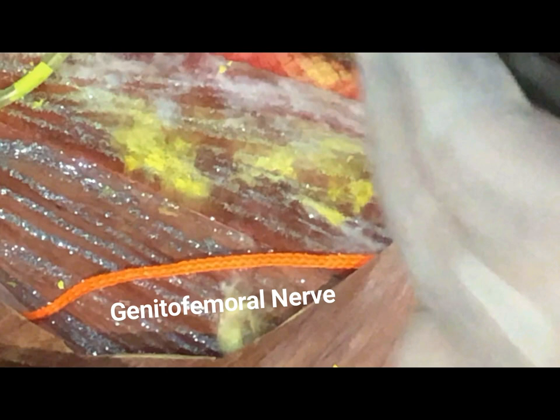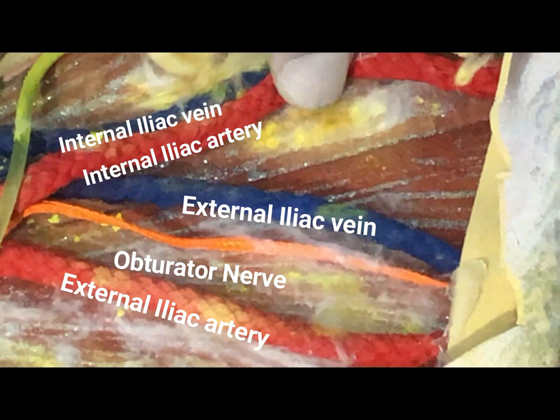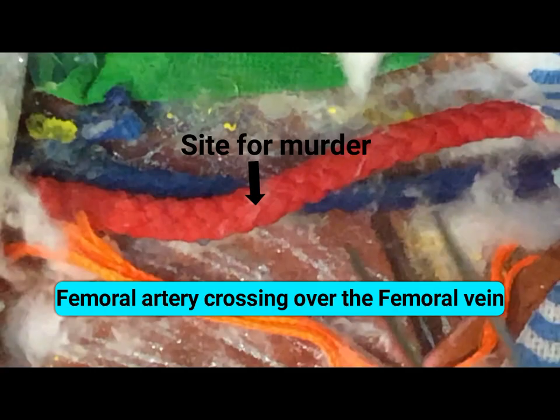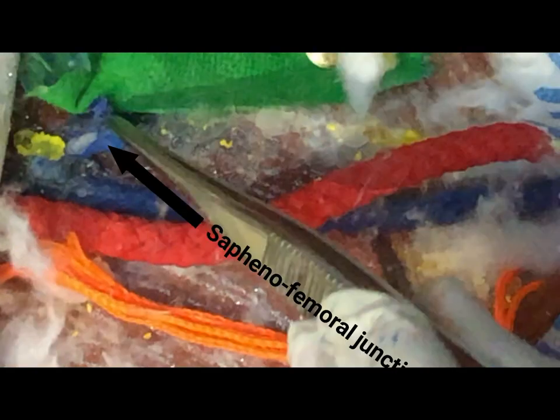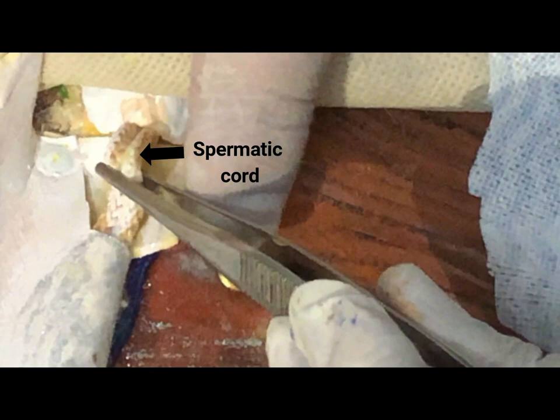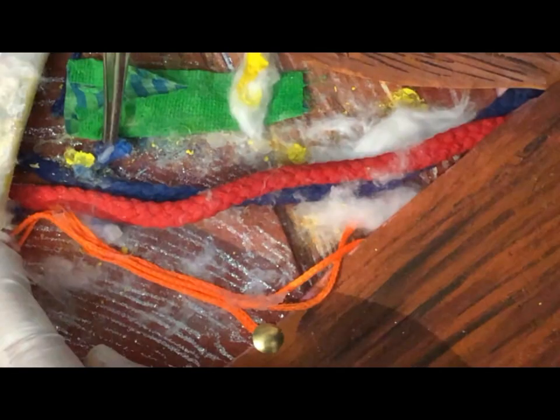Flap failure is a major problem in ilio-inguinal block dissection. It's important not to use a lot of diathermy and not to make very long lateral flaps, which is why there are many modifications of incisions. Classically, if one has a fungating lymph node — a common scenario in this part of the world — or a post-irradiated patient, many people prefer two parallel incisions: one in the suprainguinal region and the other in the infrainguinal region, with a gap of about five to six centimeters. These lines diverge away from each other, which keeps the skin paddle in between viable. Many people like to take a lazy S incision.